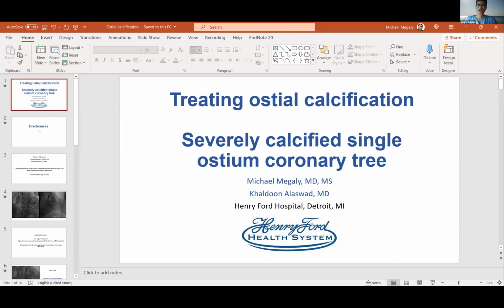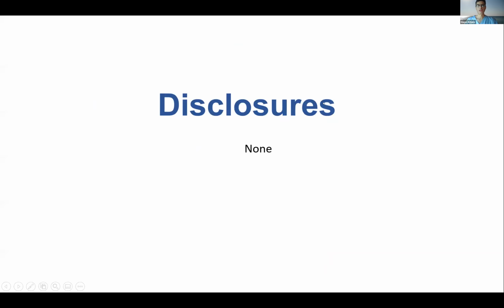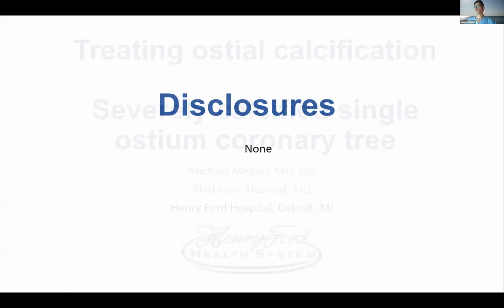To be honest, I'm not so sure exactly what the technique is, but I know that people have used, in the past, stents where they do a mini surgery, take a vein, put the vein around the stent and deploy the stent with the vein in the perforation. Sounds great, but I'm not sure many of us have the skills to first take the vein safely, and then also deliver and deploy it safely at the site of the perforation. So I think that's not done quite any place right now.